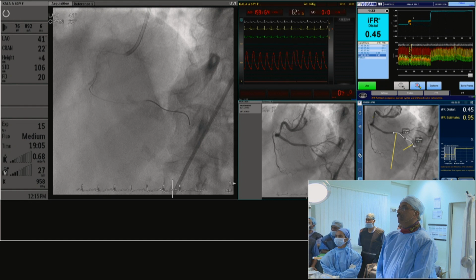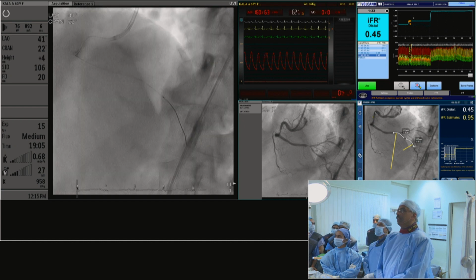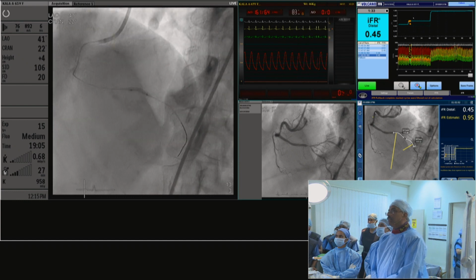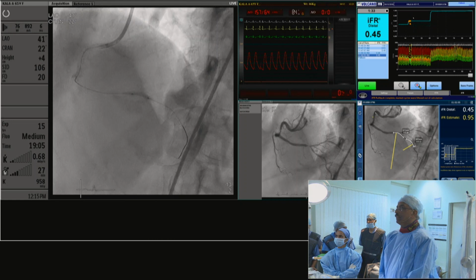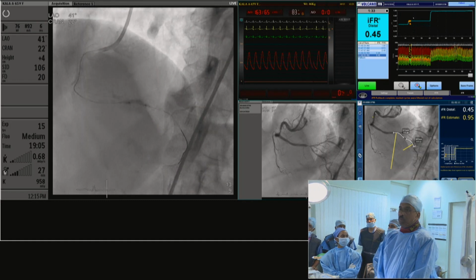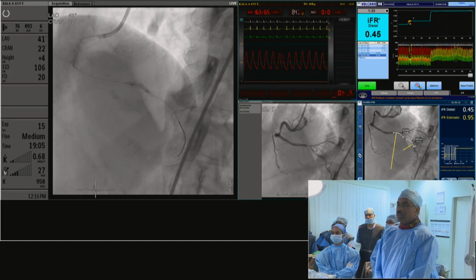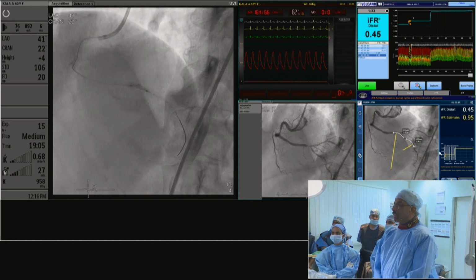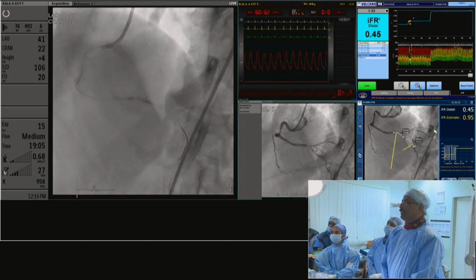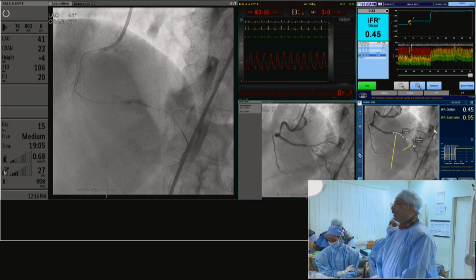So would you actually say that this is one of the advantages of IFR over FFR, in the fact that you don't need to do away with lesions interacting with each other and therefore are able to get physiology at multiple points without bothering about interactions and pre-treatment, etc.? Yeah, I think this is critically the most important advantage that IFR today gives. Otherwise, with FFR, you need to fix the tight lesion first and then look at it again. But IFR is independent of this, and clearly that's the lesson which IFR teaches us. So we know that now, which is the lesion creating the problem.